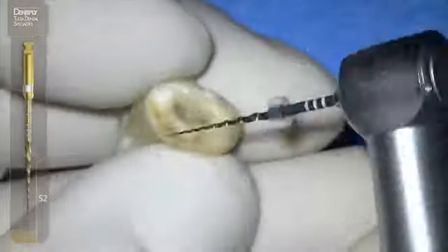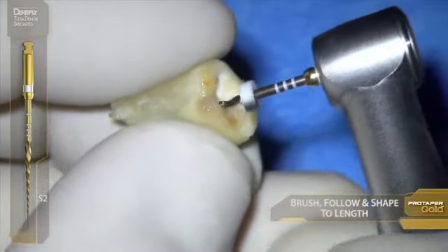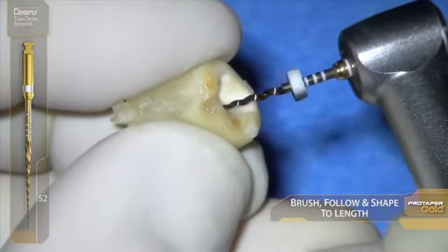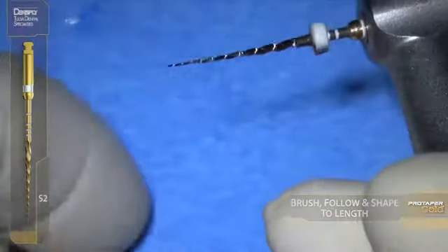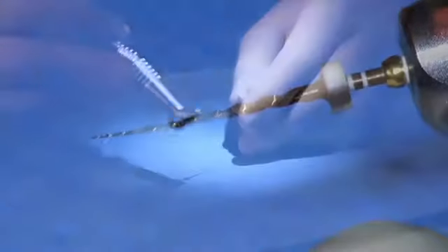Then we bring in S2, purple, white, yellow, red. So white, S2. Again, the watchwords are brush and follow, brush and follow. No pressure really at all, just the weight of the handpiece, brush and follow, and the geometries are cutting where they need to cut to remove restrictive dentin.